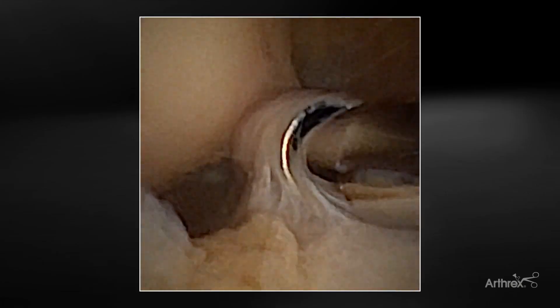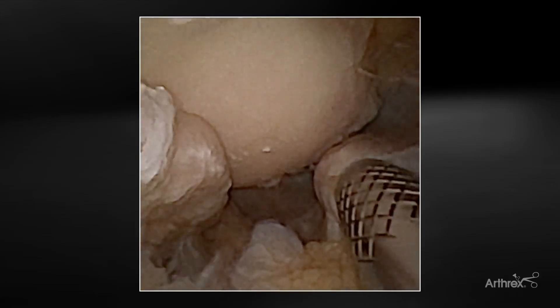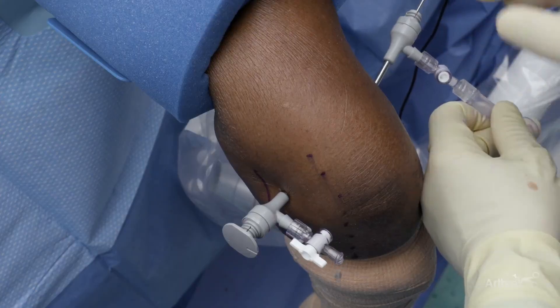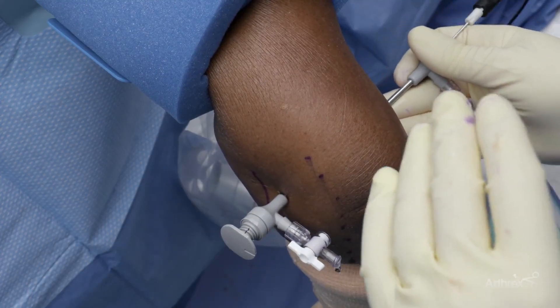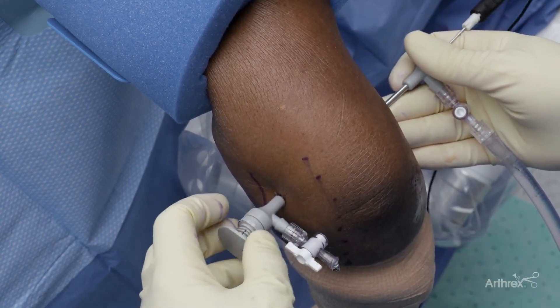We now have our cannula on the ulnar side. If you wish, you can use a shaver to do synovial work on this side. If there's a bone spur, you can use a little burr right there to clean that up. You have an excellent view of the entire ulnar aspect from this portal. One of the things that is very nice about this system compared to other arthroscopy systems is that because of the dampening and the way the flow is set up, we are able to get minimal water loss. We're not getting the soft tissues distended, so it's very nice in that regard.